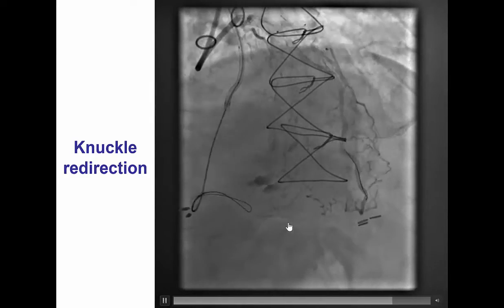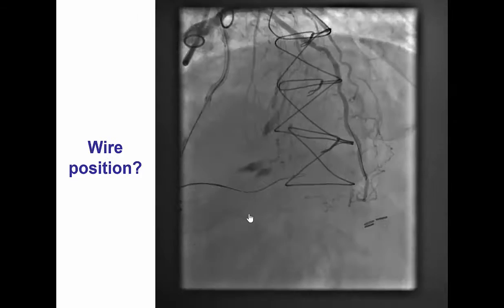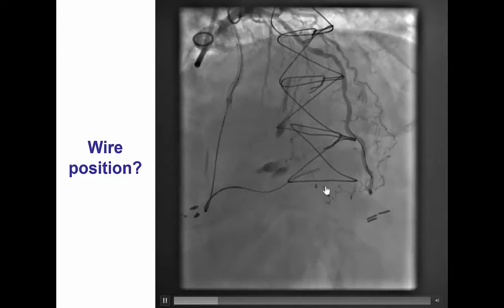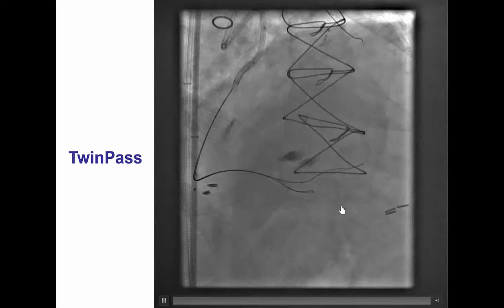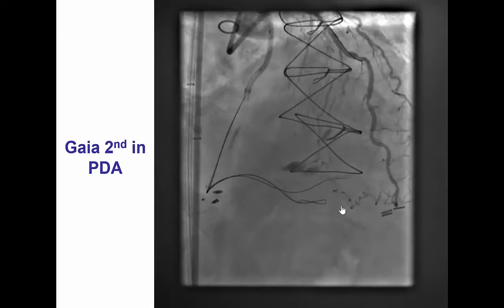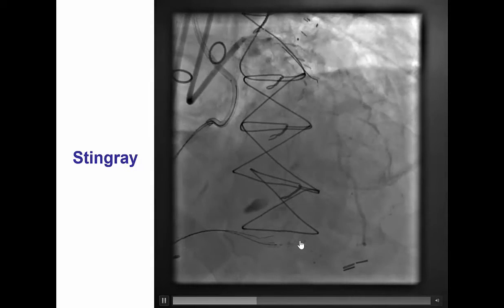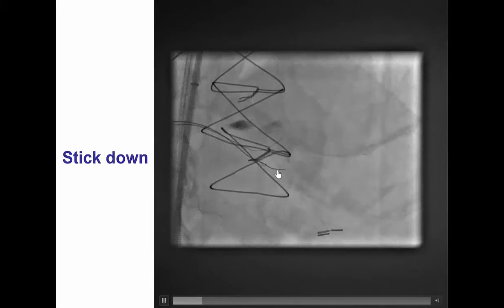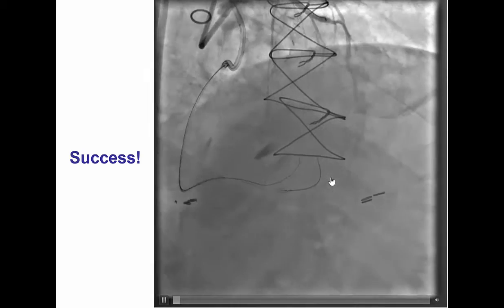We can tell that the vessel is very, very small. The wire went into a branch of the posterior descending artery, and then we used the TwinPass catheter to redirect another wire into the posterior descending artery. We then advanced a Stingray balloon close to the PDA, which is a very small diffusely diseased vessel. By doing the dual blind stick and swap technique, sticking up as well as down between the two Stingray markers, we were able to advance a Pilot 200 into the posterior descending artery.